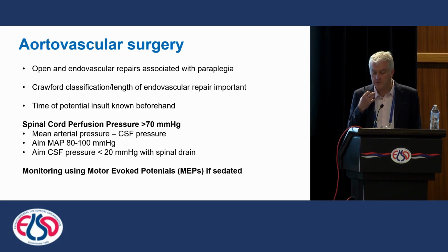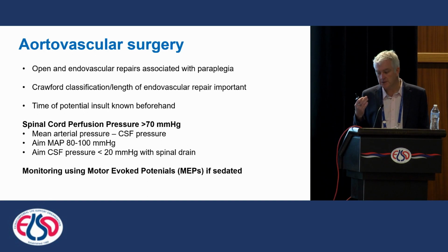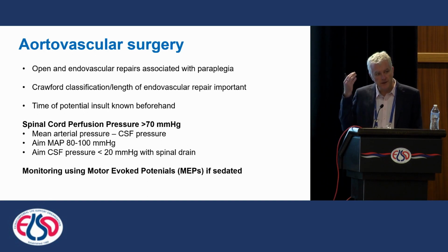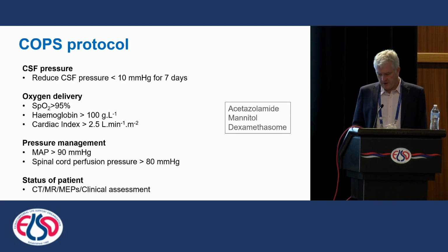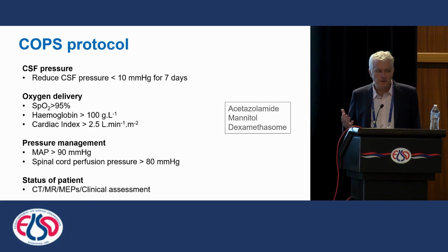We do motor evoked potentials in theatre whilst the patient's sedated, which is where we're stimulating the brain and we're watching the motor signal in the big toe usually. And if those MEPs disappear, or suddenly we wake the patient up and they aren't moving their legs, then we move into what we call our COPS protocol, which is a little bit empirical, but it's what most people use based on the literature. And this is where we try and reduce the CSF pressure further so we get a better perfusion of the spinal cord.